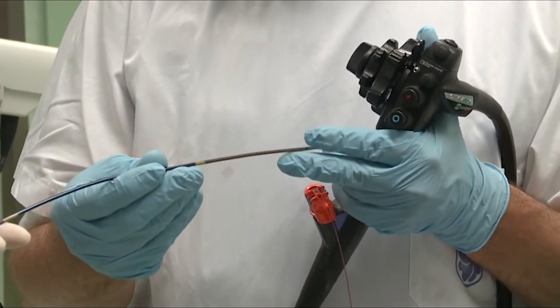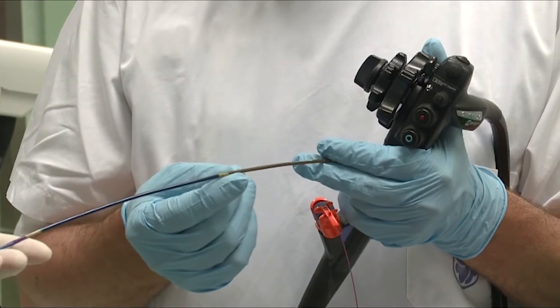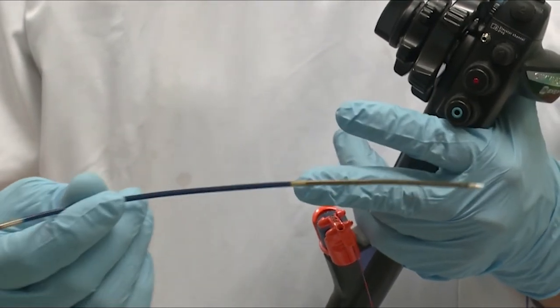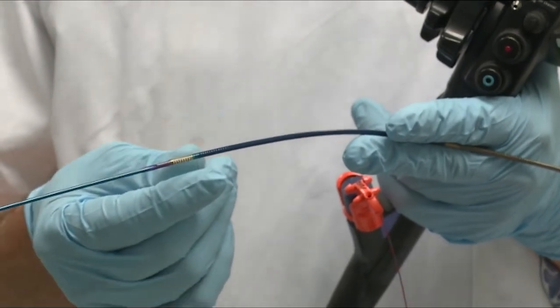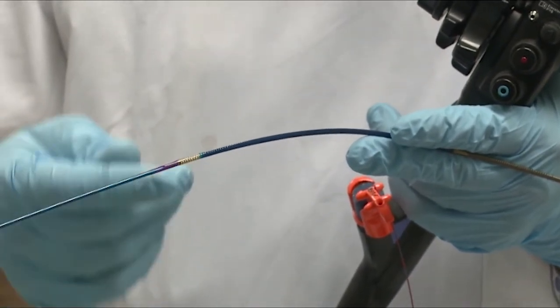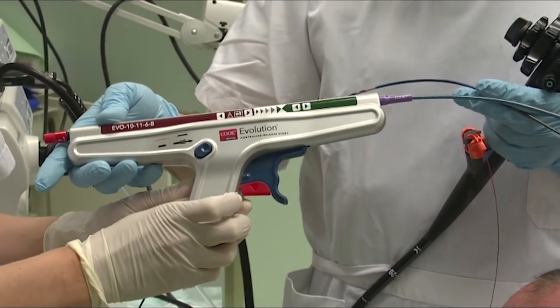As you can see here, this is the stent mounted on the catheter, with a very nicely visible endoscopic marker, which we will also show when we introduce the stent in the patient, in the duodenum. And here you see the zip wire port at 27 centimeters from the distal tip of the stent, where the wire will exit, so a short wire introduction system. And then we go all the way up. This is the handle of the device by which we will deploy the stent.